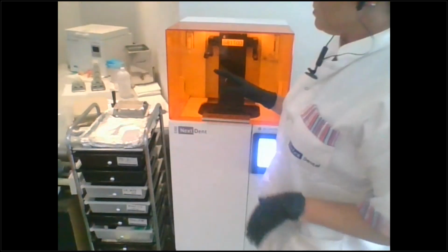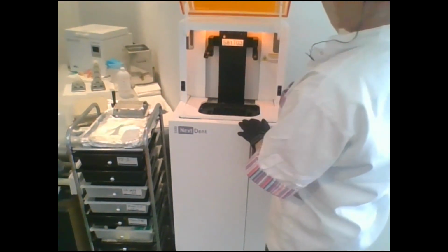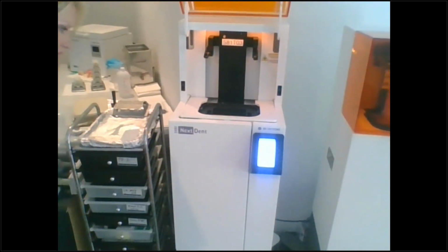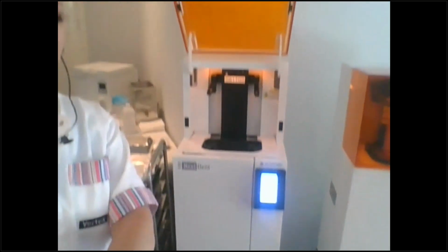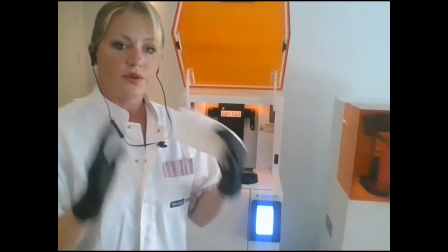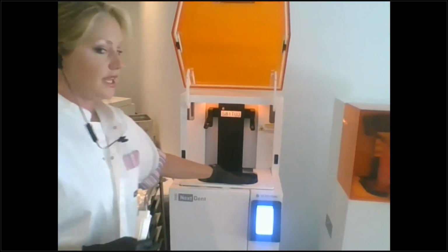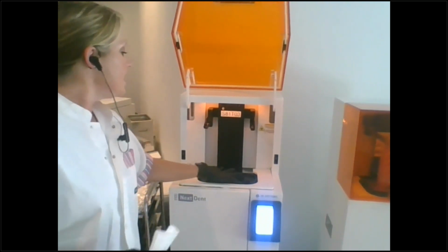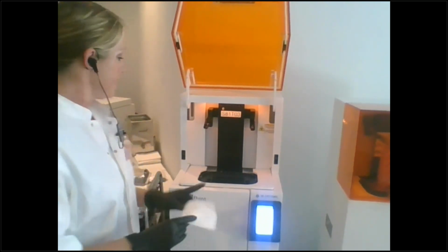So I am also going to clean the lip of my resin tray, where my resin tray goes in my printer. And when I change out materials, I always make sure I do that. You want to make sure that your printer stays clean. There's not much maintenance to do on the printers at all. There's no calibration, but you want to keep it clean. If you get anything on this lip right here, this is where your tension is on that membrane. And so you want to take really good care of that thing so it lasts you quite some time.